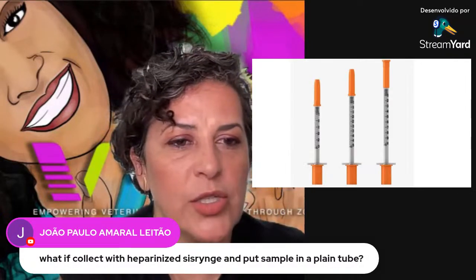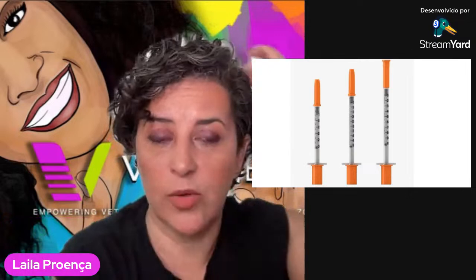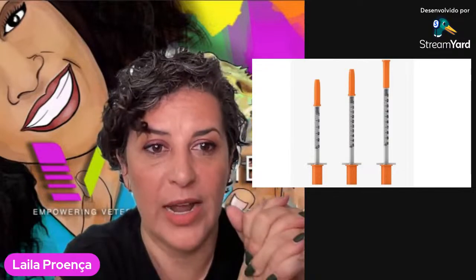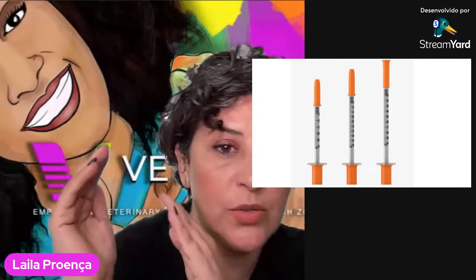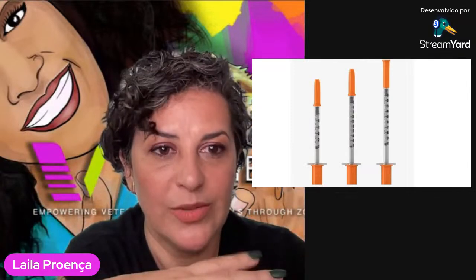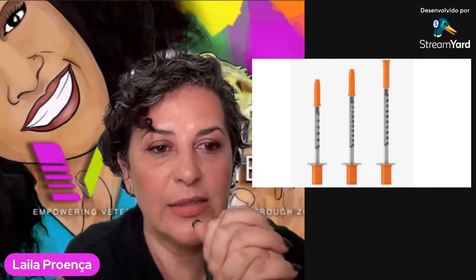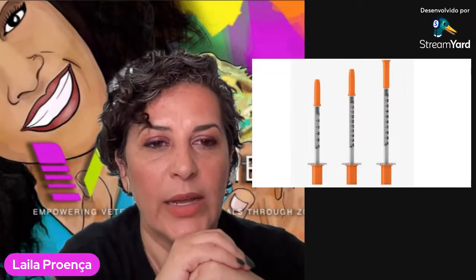I will ask you a question, João. What if I collect with heparin syringes and put the sample in a plain tube? That's a great question, actually, João. But the problem is, how do you know how much heparin is in the syringe that we heparinize? Because the heparin needs to be so many mLs of heparin to so many mLs of blood, right? So how many mLs of heparin did you put in the tube? And do you know how many mLs you need to put in the syringe to be a good dilution that's not going to be hemodiluted? That's the problem, because you don't have a way to know exactly the amount of heparin you have to the amount of blood you need for that amount of heparin. Does it make sense? So that's why it's not very helpful.